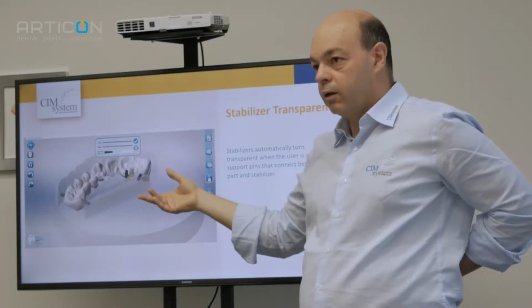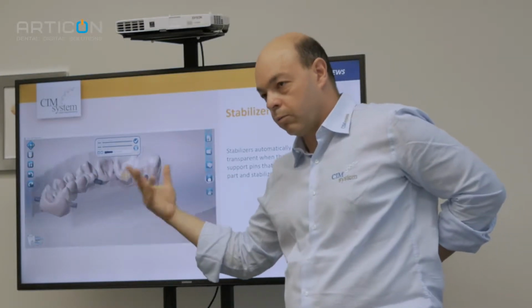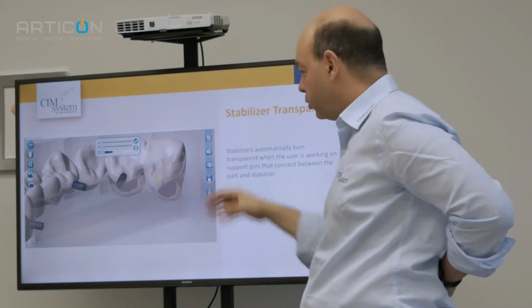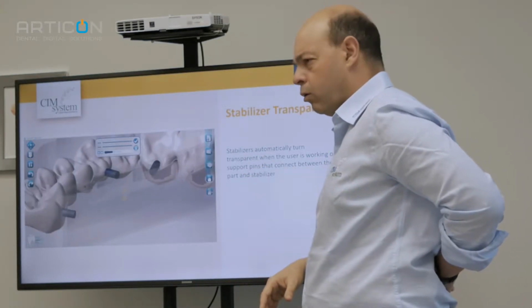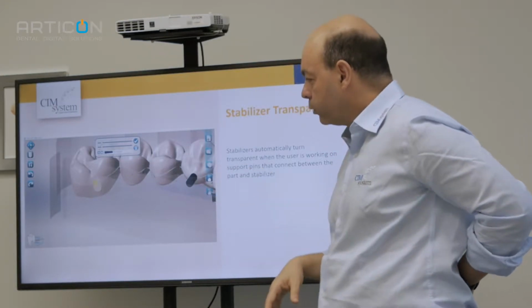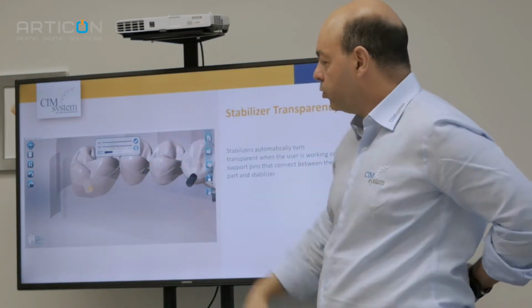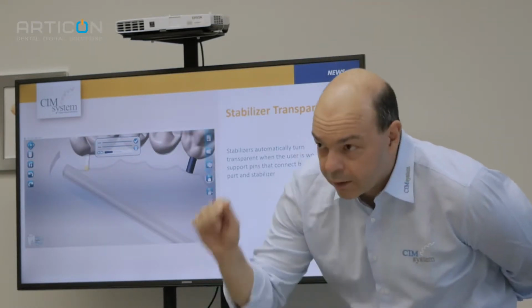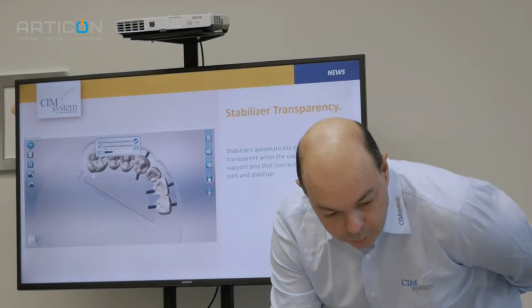I have another news for the stabilizer, which I will show you in the live demo, because I didn't have time to put this news in the PowerPoint. Now when you need to move the pins, it's very easy. It's automatic. You click and the pin is automatically put in transparency.